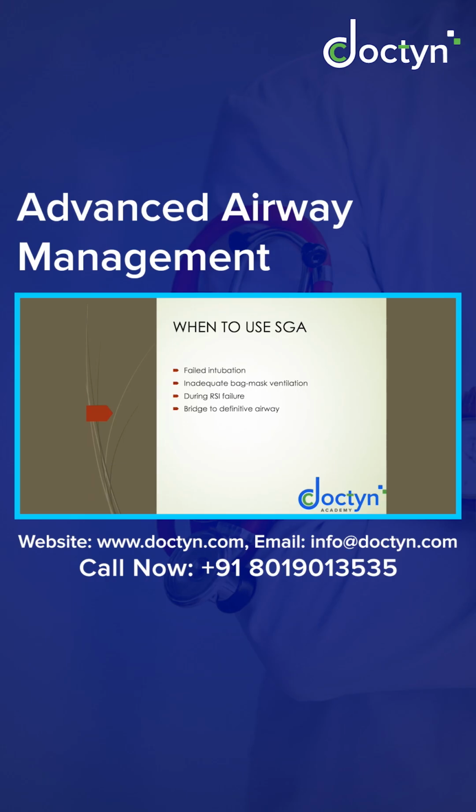The patient is unconscious and you have decided to secure his airway because there is increased risk of aspiration and he is not breathing well. Right now we give a jaw thrust and ventilate with an Ambu bag with 100% oxygen. So the oxygenation is maintained now. Next step, you try to secure a definitive airway, which is intubation.